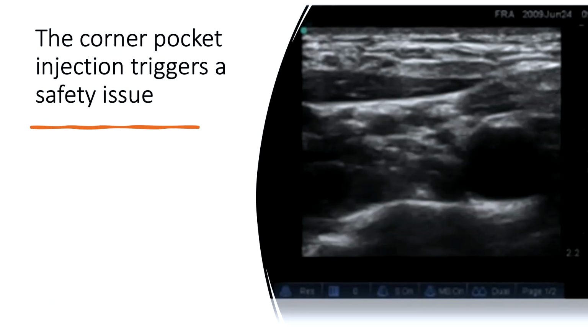and you can get answers to some of the questions that we have. Now, the need to bring the needle this close to the first rib produces a safety issue. And I cannot really overemphasize this. This is the problem with the supraclavicular. You still see people getting pneumothorax in the era of ultrasound. And it shouldn't be. But it's unfortunate that it is.